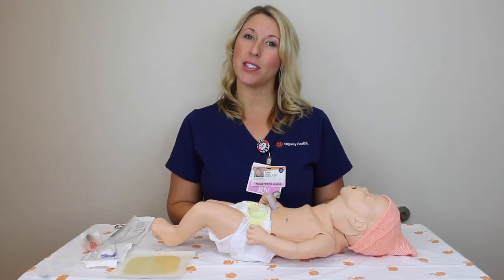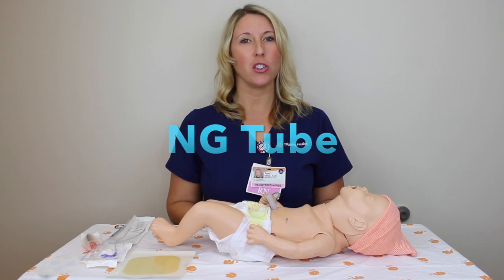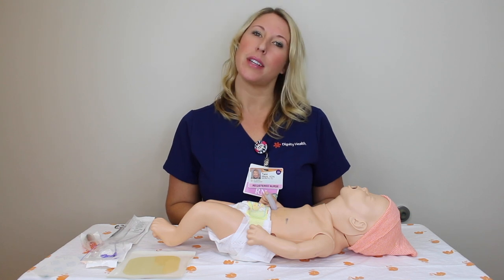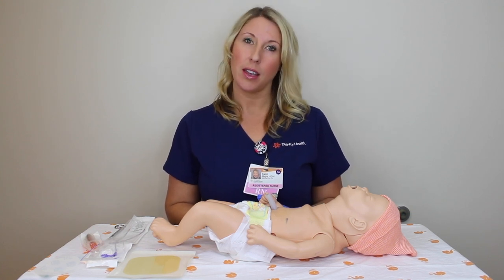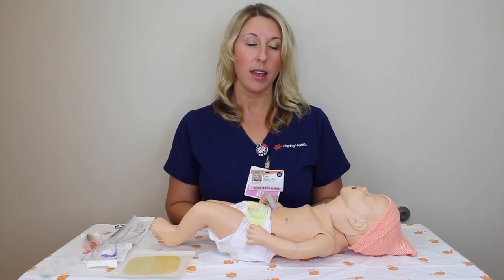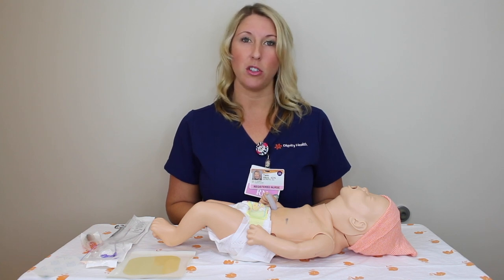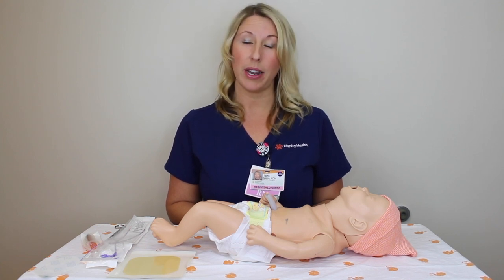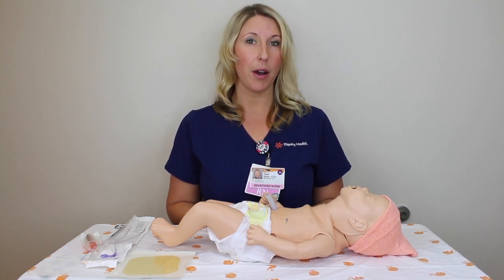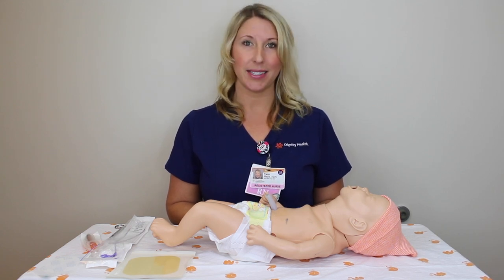Today I'm going to show you how to insert an NG tube into your patient. There are a couple indications for using an NG tube. One would be to assist with feeding, which requires a physician's order. The other is during resuscitation, where you would follow NRP protocol and procedures. Please review the following policy and procedures to see when an NG tube would be necessary.